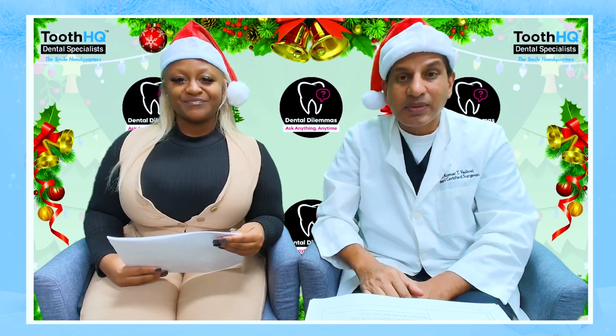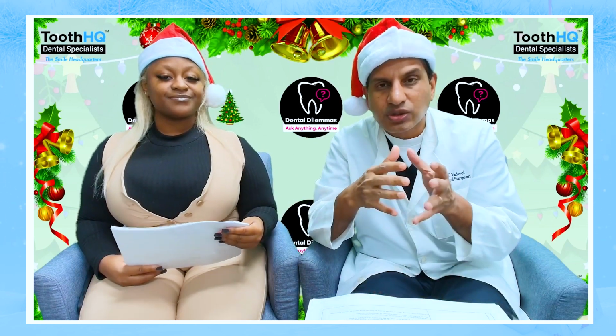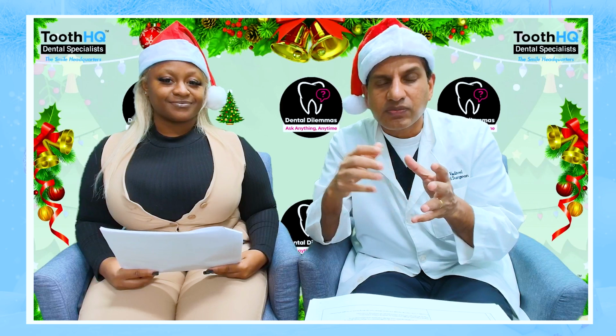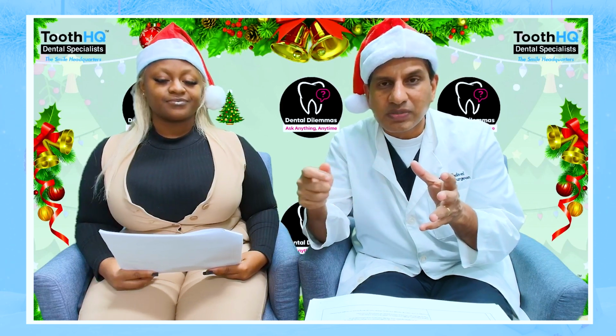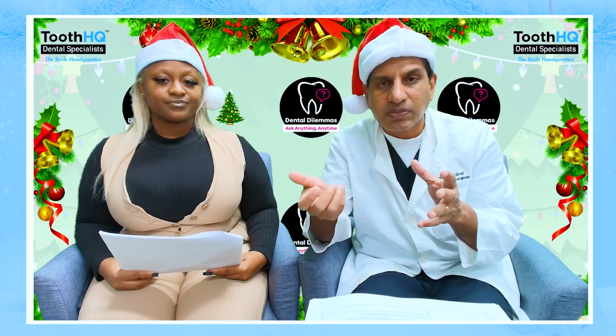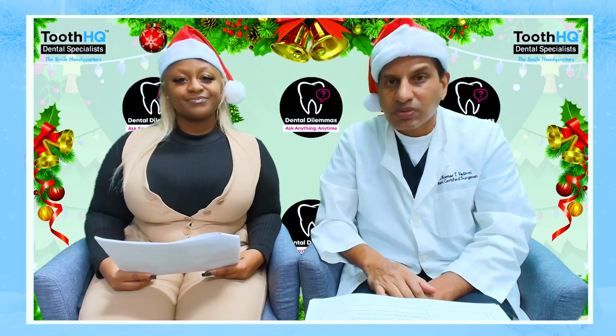And then expedite the healing process, which I call it, right? So if you are going to take, let's say, 3 months for the bad breath to get better, by immediately killing those bacteria, you are going to expedite your healing process, and thereby you are going to have a faster, fresher breath.